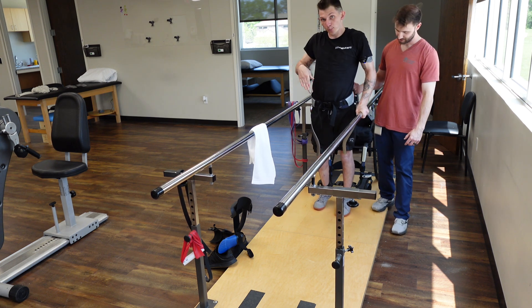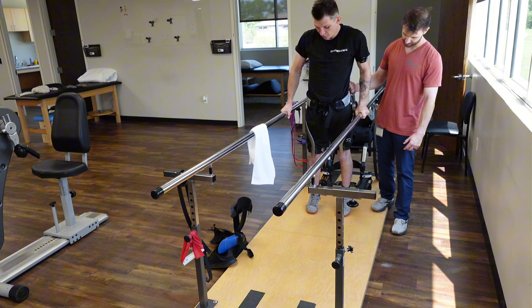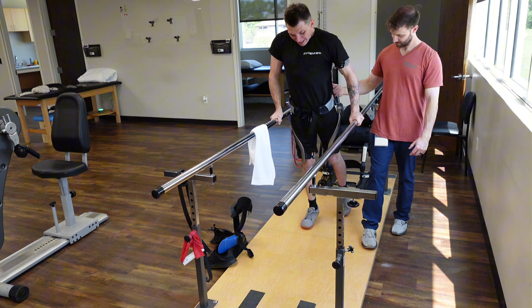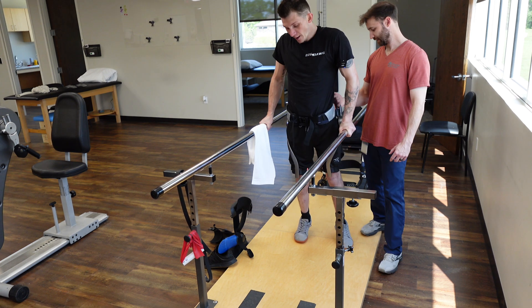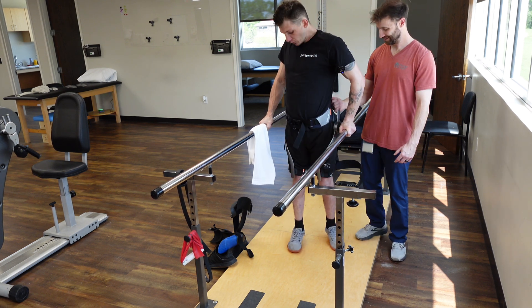Y'all see how my feet point down? It's hard to get that stiff. We're far away from walking without the braces, but we're one step closer.